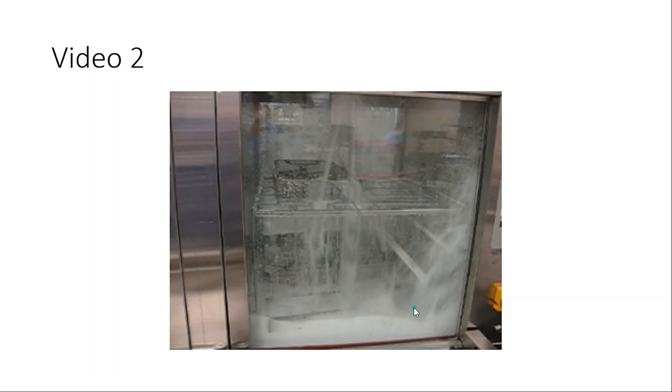Human error combined with mechanical error — the dosing pump not working correctly. Look at all that buildup — it's going to block those spray arms. There are calcium deposits. This is what people were doing and putting their instruments into every day. Look at the calcium on the side walls — this is why you put a quality process in place and review what's going on. That calcium buildup is going to end up on your instruments.